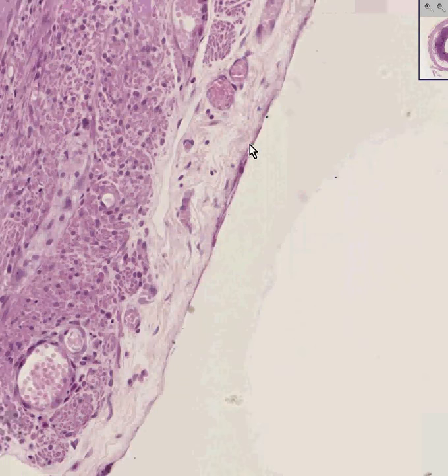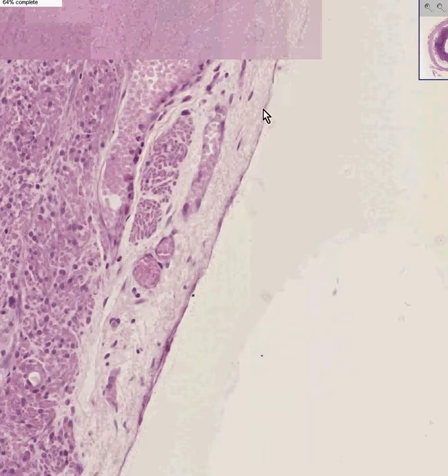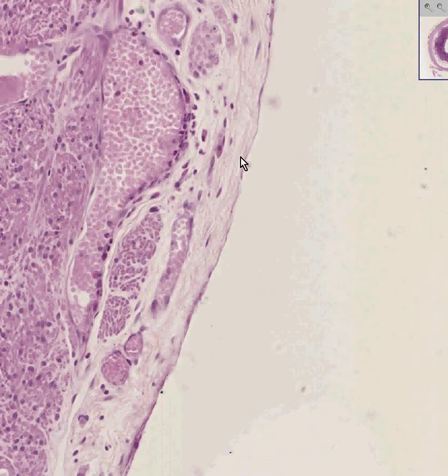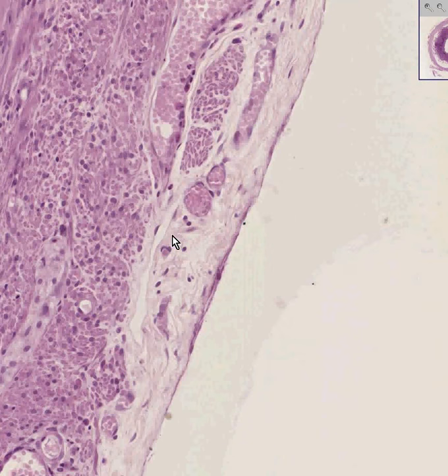and the appendix is clearly intraperitoneal, so you are absolutely allowed to see mesothelial cells like here, and here, and here, and here, and here, where you can see the actual nuclei. These are true mesothelial cells covering the surface peritoneum. You would not call this adventitia. You would call this peritoneum or serosa or visceral peritoneum.